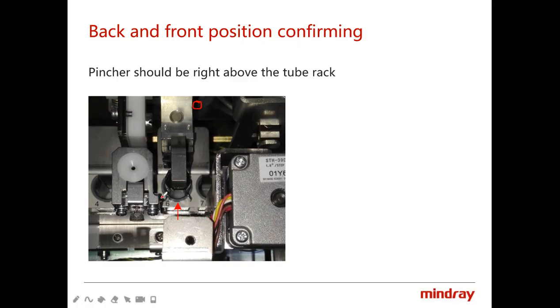For the good position, you can manually put a sample tube into the pincher, and then observe whether it can move smoothly into or out of the hole.